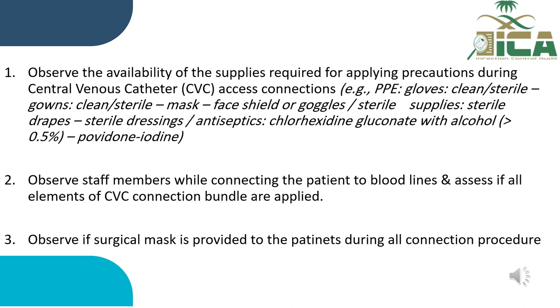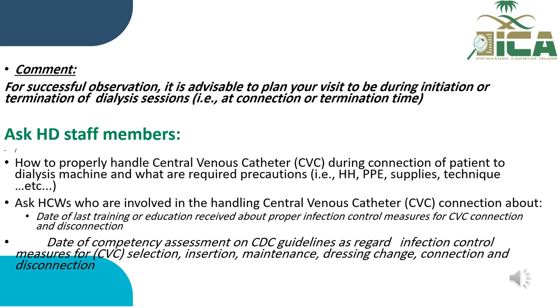Number two, observe staff members while connecting the patients to blood lines and assess if all elements of central venous catheter connection precautions are applied. Number three, observe if a surgical mask is provided to the patient during all connecting procedures. For successful observation, it is advisable to plan your visit to be during initiation or termination of dialysis sessions, like connection or termination time.